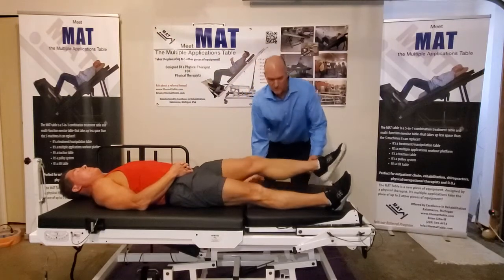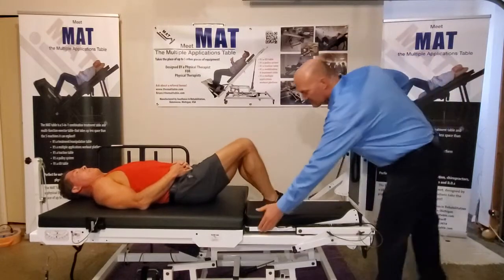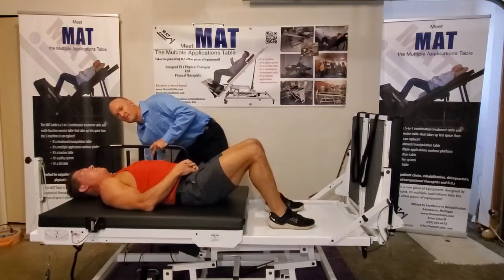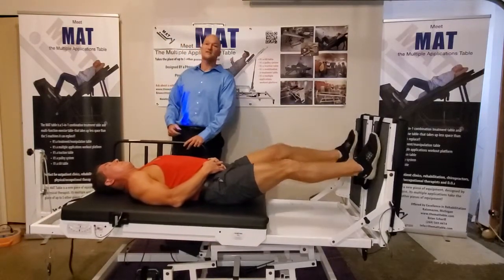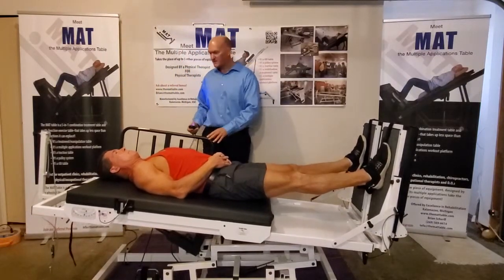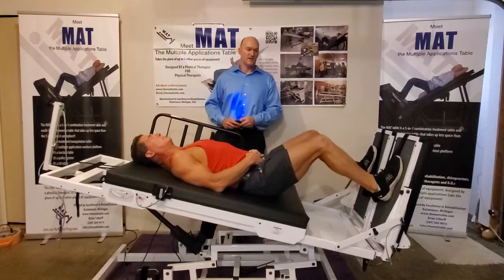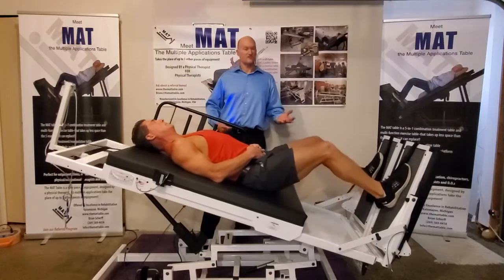Very simply, you raise up these individual foot platforms — they automatically lock in place — then you undo the brakes, which are there to make the patient more comfortable when getting on and off the table, and you raise the table to your desired height. The table goes up to 45 degrees. It is equipped with a flexion stop hand controller to control the amount of knee bend, and the patient proceeds to their exercises.